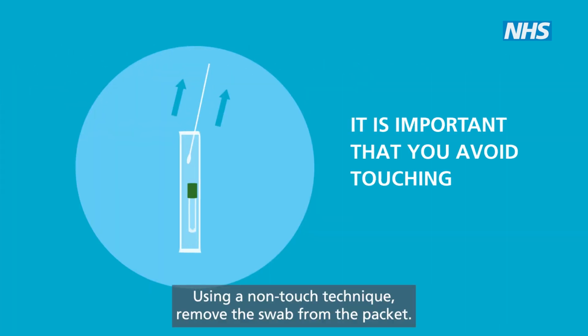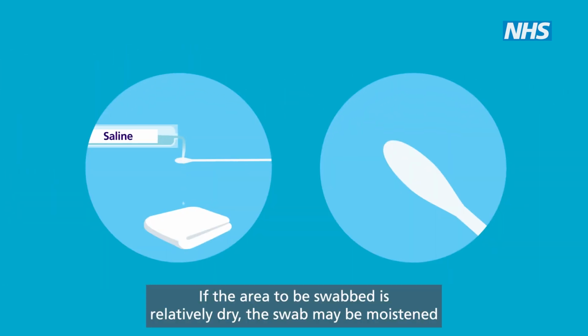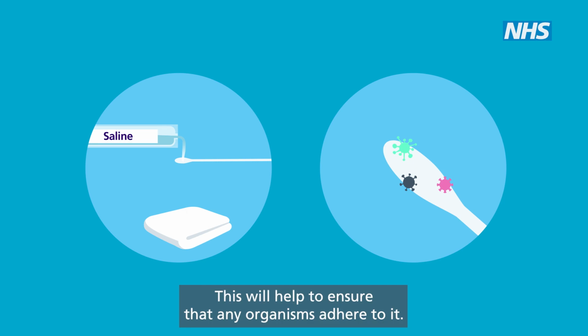Using a non-touch technique, remove the swab from the packet. If the area to be swabbed is relatively dry, the swab may be moistened using sterile sodium chloride, taking care not to touch or contaminate the swab. This will help to ensure that any organisms adhere to it.